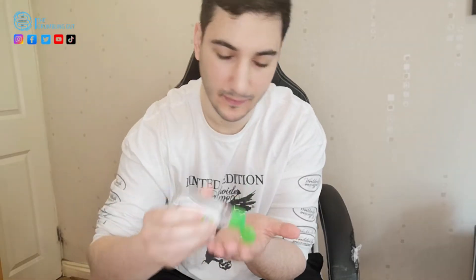Before you start injecting yourself, make sure your hands are clean and you have everything with you. I've got my sharps bin, some swabs, and some plasters just in case. And just to be on the safe side, I'm going to anti-bac my hands.